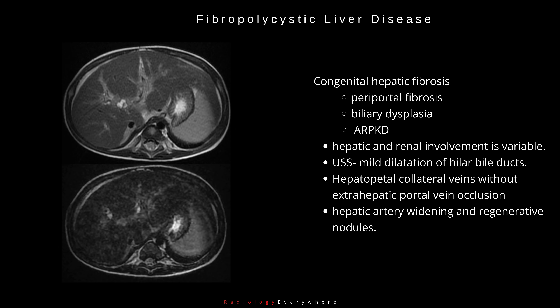Congenital hepatic fibrosis manifests as periportal fibrosis, biliary dysplasia, and autosomal recessive polycystic kidney disease. Both the hepatic and renal involvement is variable.